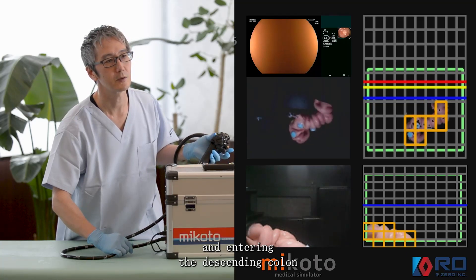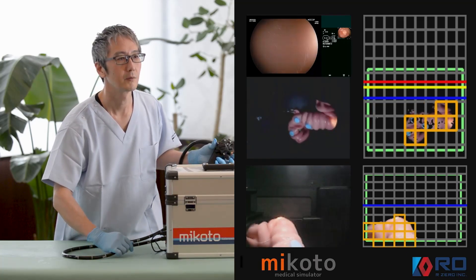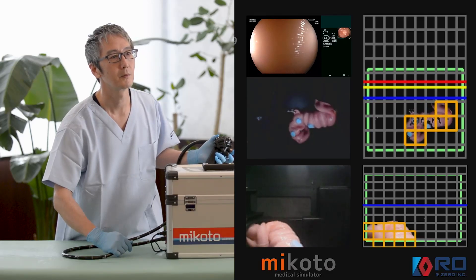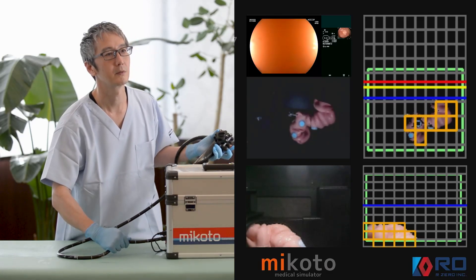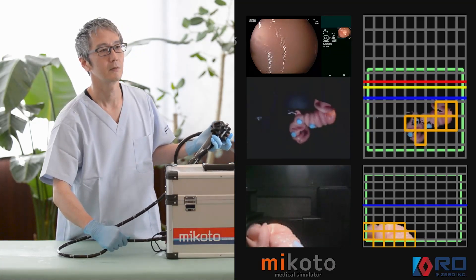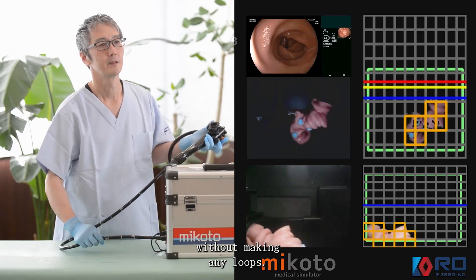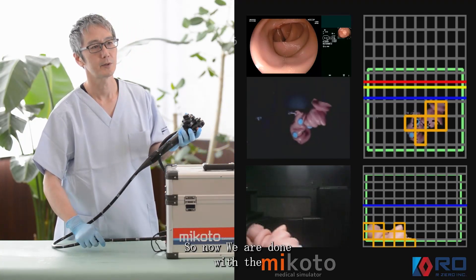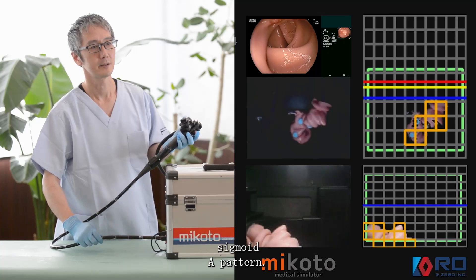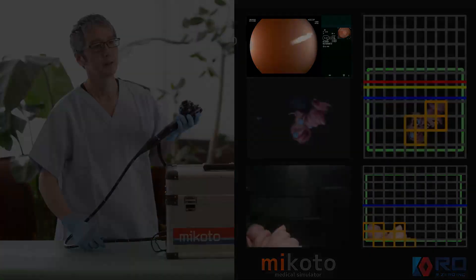Enter the descending colon without making any loops. Now we're done with the sigmoid A pattern.